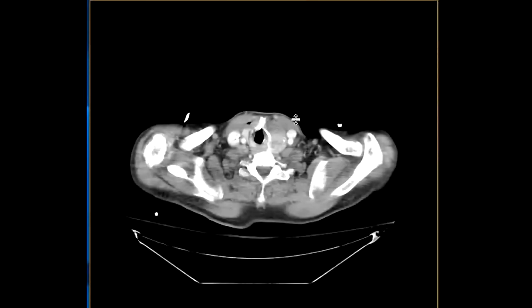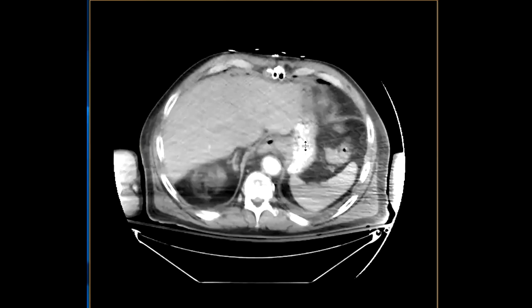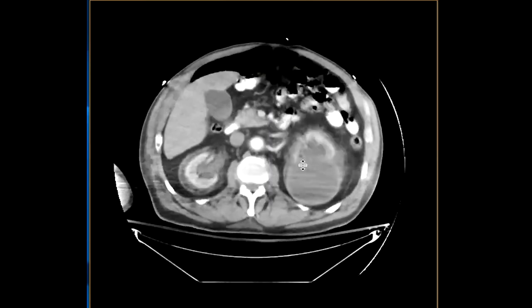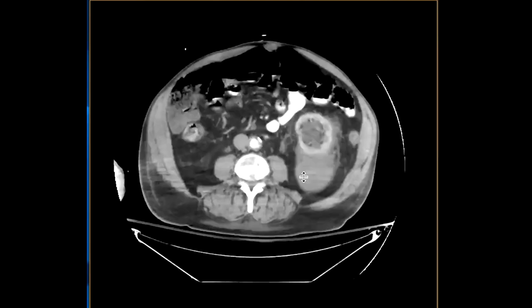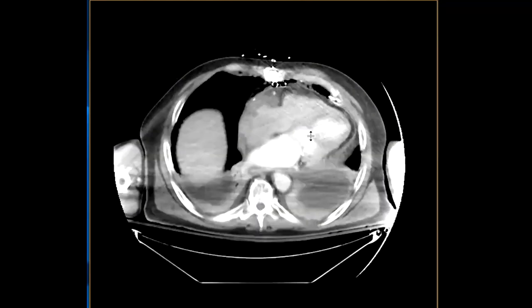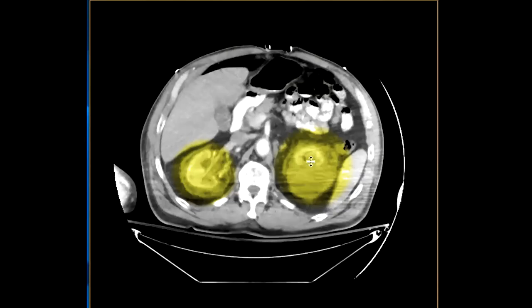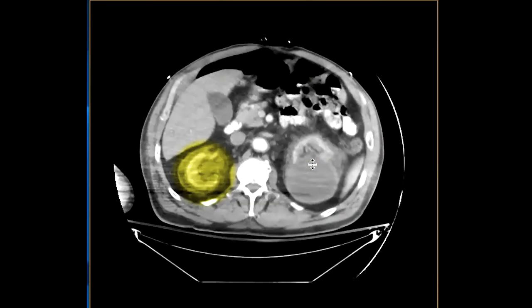Here we have a 72-year-old male with pain. They did a pan scan to evaluate the etiology of the pain. I'm going to focus on the abdomen, and specifically on what's happening around the kidneys — let's start with the right kidney.